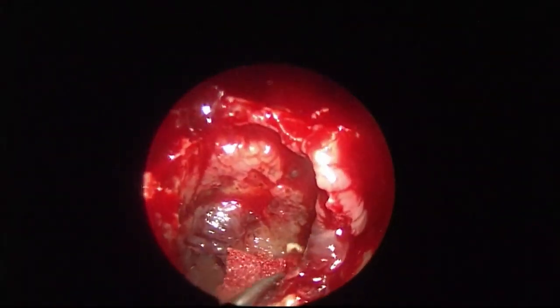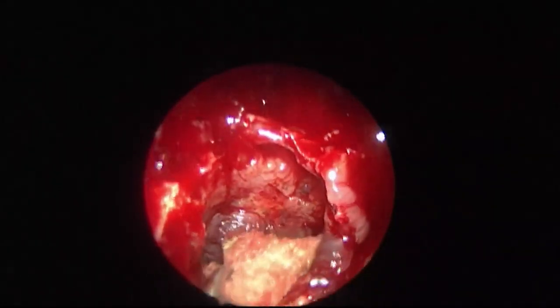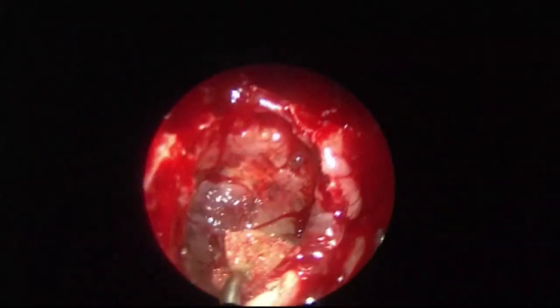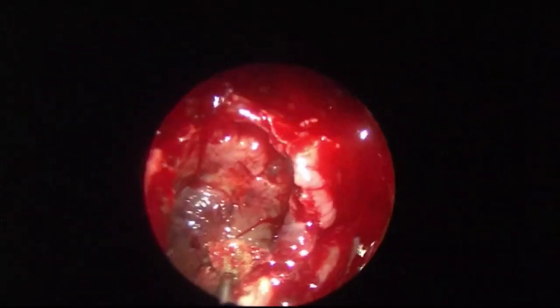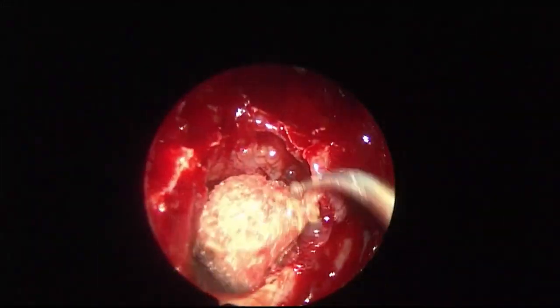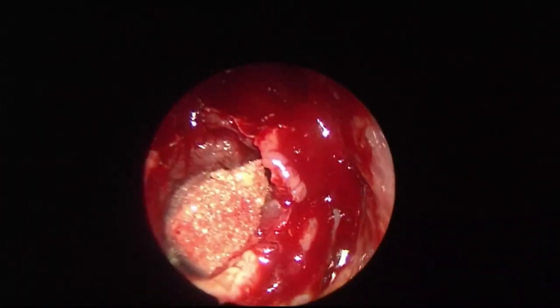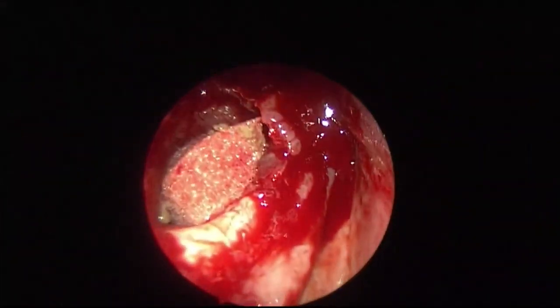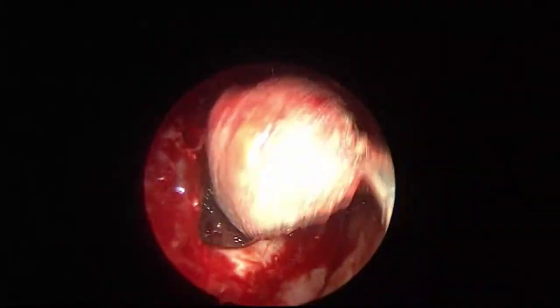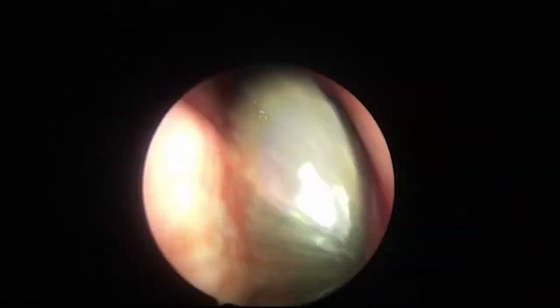Hard mopping. Mopping really hard. I'm very hard mopping. Remove anything left behind. Flush. Now we'll flush it. Super. See now, we'll flush under vision.